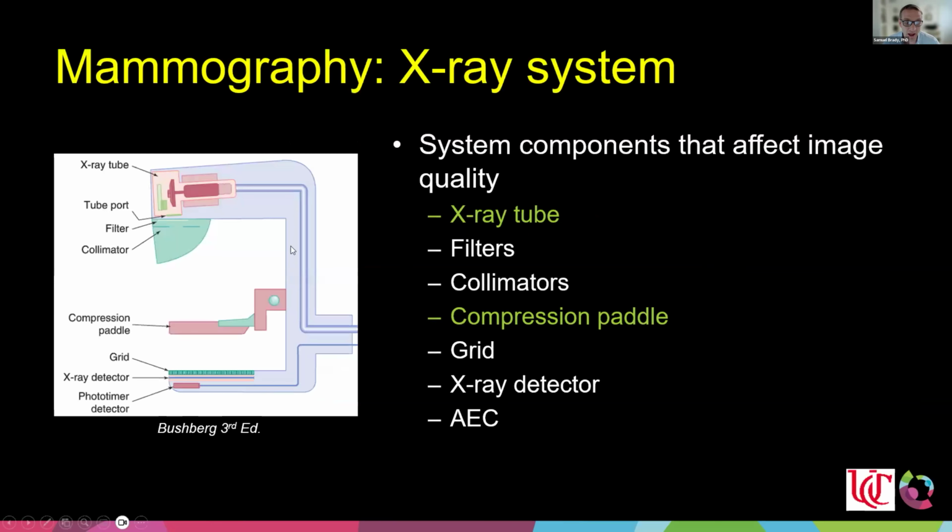So when we look at the X-ray system itself, the mammogram system itself, it's really not much different than any other X-ray system we've talked about previously, and that you've probably learned and used over the course of your career. The difference is basically in the structure. It's smaller and more compact.